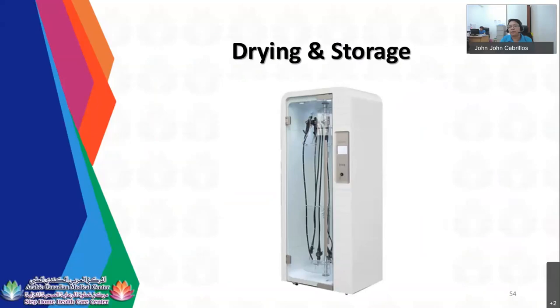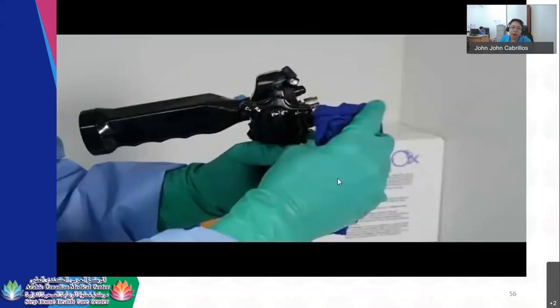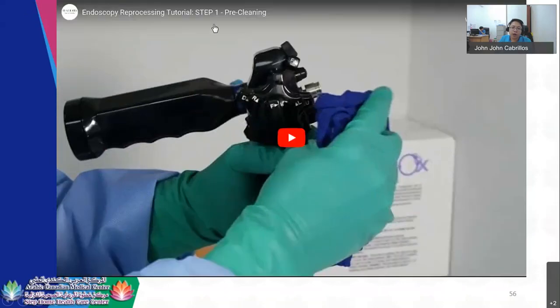Once you transport it, there's actually a specific bin or container used when transporting your endoscope. I'll show you some videos in a while, so let's proceed. Surgical instruments staining, there are different. Just a moment, I think this is already the video. So this is your endoscope. Step one, pre-cleaning.